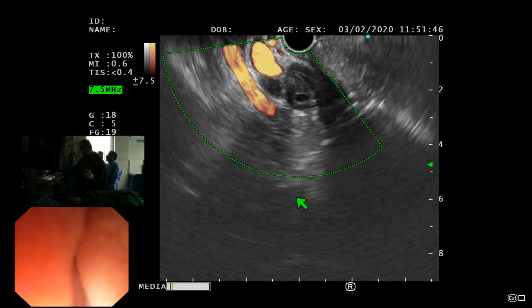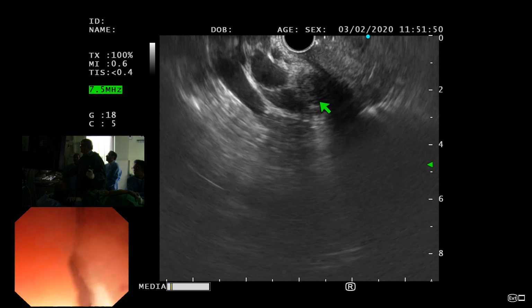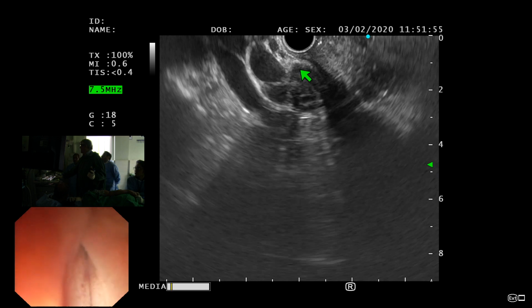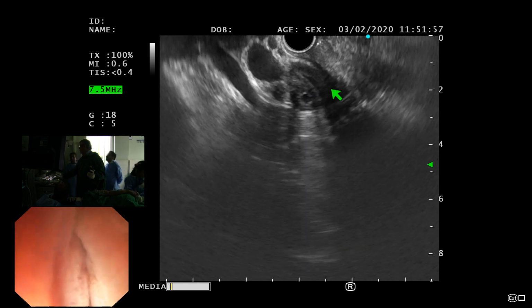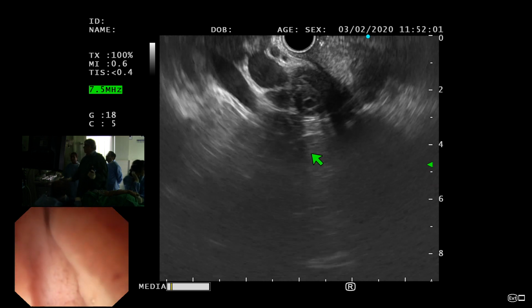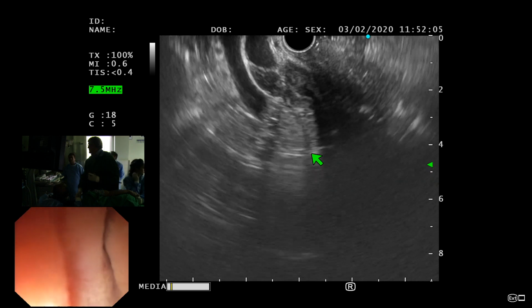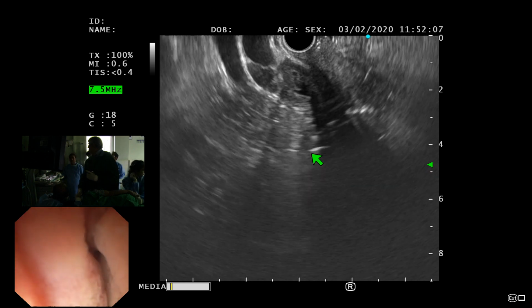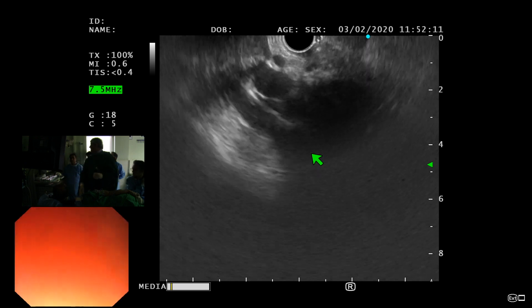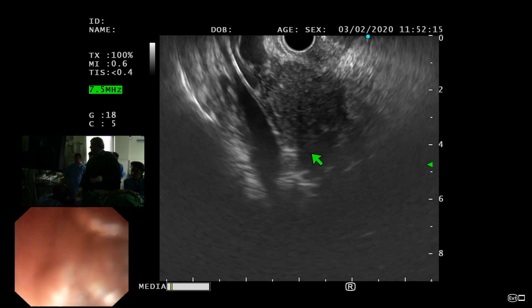That is the pancreatic duct. Okay, and just above that, here is the CBD. Okay. Wasn't there a stent? This is all very inflamed area. This whole area, and when I follow this PD towards the head, where is the stent? Can you see there? Where is the stent? I'll show you the stent. Just give me a second.